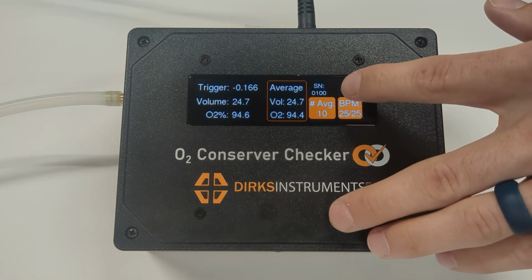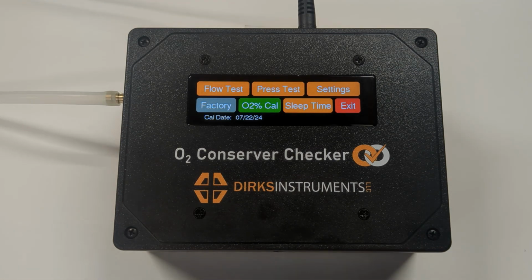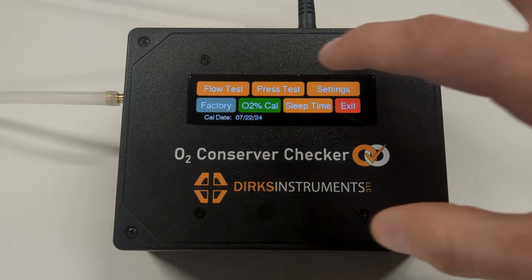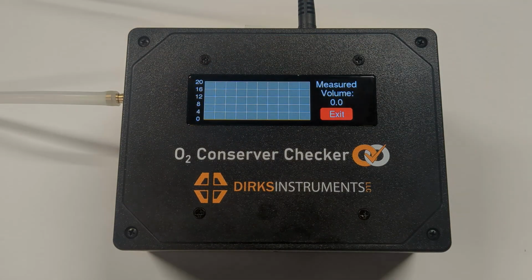In the Settings menu, we have a variety of functions that we can access, as well as our basic device settings. At the bottom of this menu, we can see the last time the device was calibrated. The first function available is the flow test. This lets us test the flow calibration of the device with a known volume.